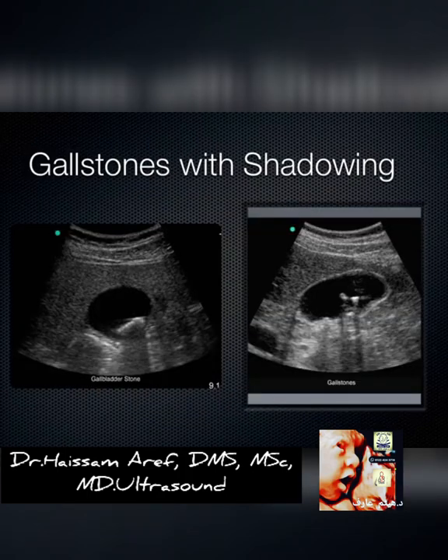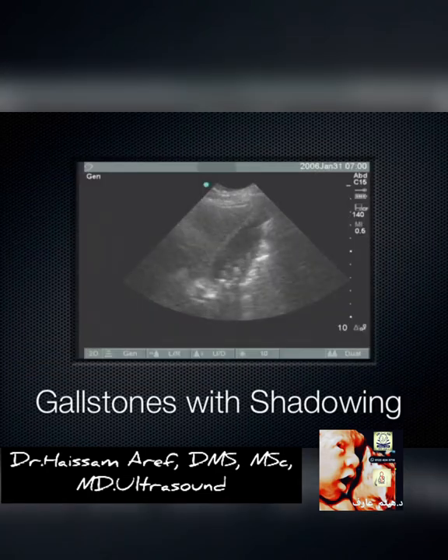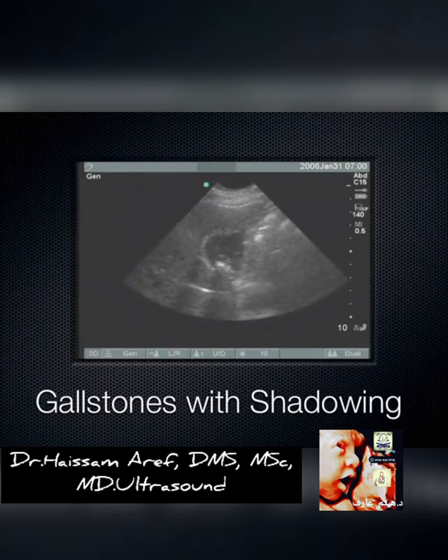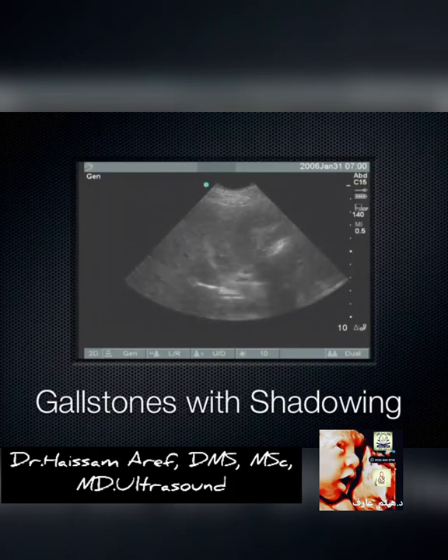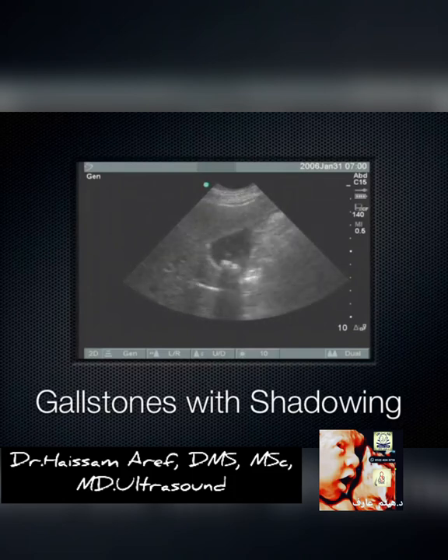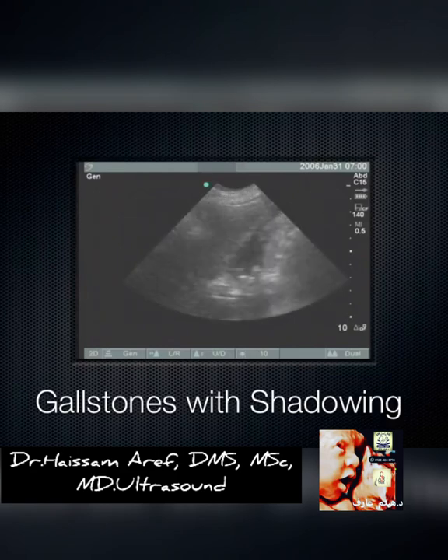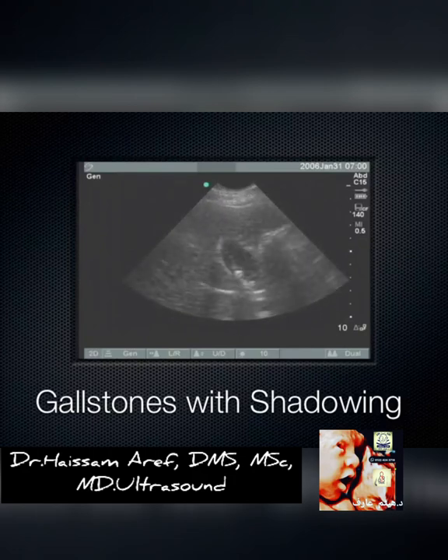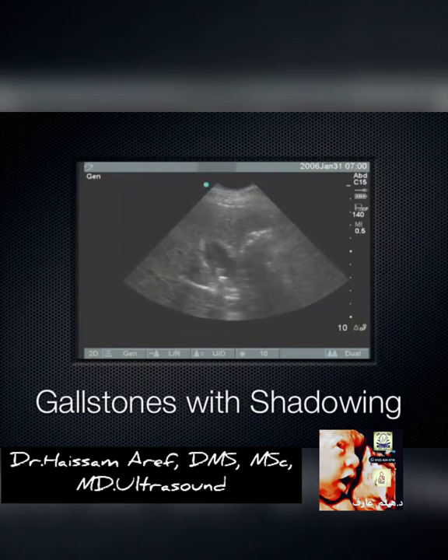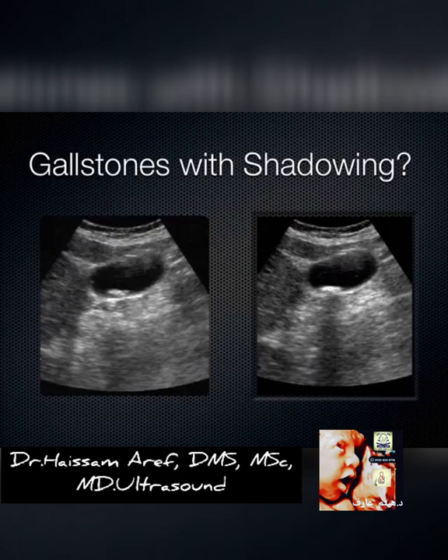Here are examples of gallstones with shadowing. It's an unbelievably common disorder — in our emergency department we see gallstones roughly every hour in a 24-hour period. It's a very common ailment whether you're in an outpatient setting, another country, wherever you go. For this same patient we made an adjustment to the machine to get the gallstone to cast a shadow — we went up with the frequency, to resolution mode. Higher frequencies attenuate more and result in shadowing being more prominent.